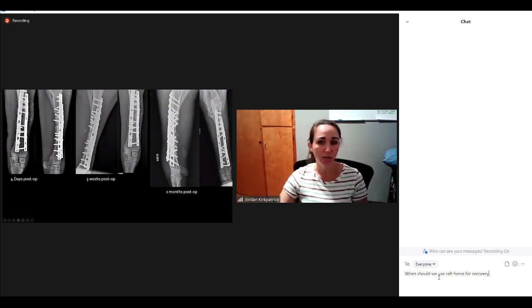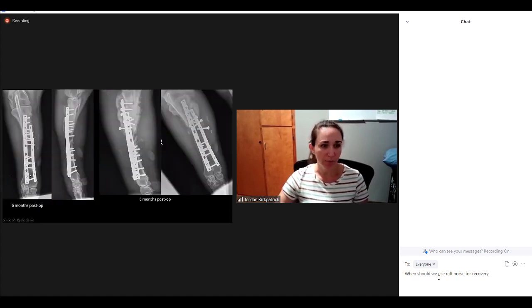And again, as I said earlier, in most adult horses, we don't even attempt to fix radial fractures because they have such a poor prognosis, because our implants just aren't strong enough. But Ruby is a pony, and so she weighed right at, I think, 350 kilograms, and the owner wanted to try, so we tried. So 2 months post-op, not looking too bad. But then when she came in 6 months post-op, there's extra bone proliferation proximally. And on the lateral view, there's space between the screws and the plate. So the screws are starting to back out.